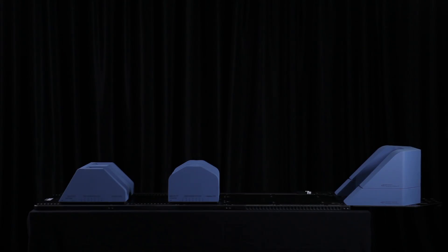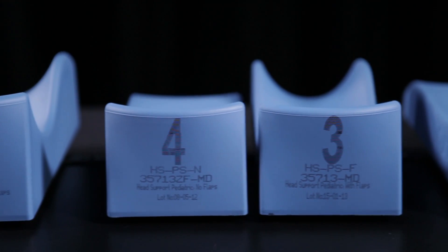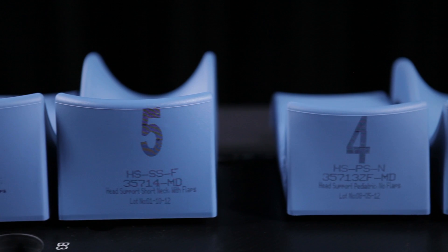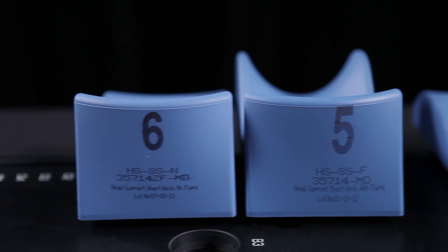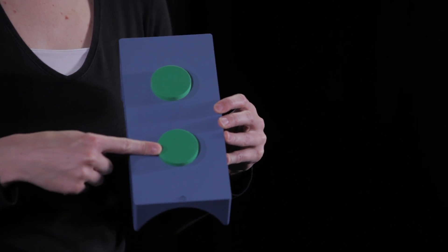The standard Orfit head supports are compatible with the SBRT solution. There are six different sizes of head supports available. The head supports have two bosses at the bottom that fit into two holes in the baseplate.